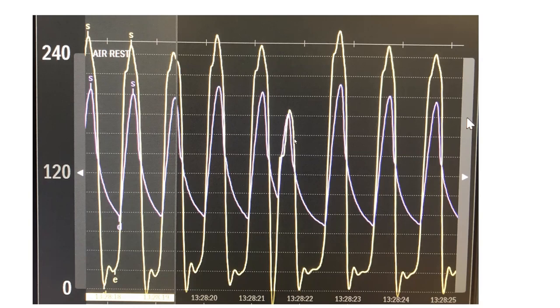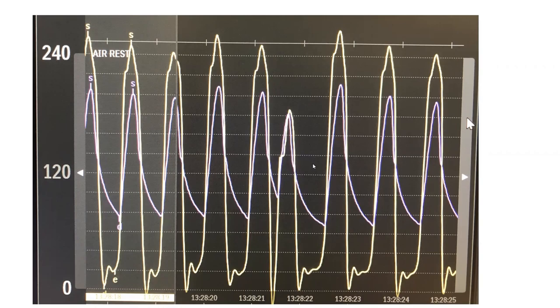Another thing that helps here is the pause. After the pause, you can see the aortic pulse pressure increases rather than declines. The gradient rises as well — everything rises: LV, aortic pressure, and gradient. So we don't have a Brockenbrough phenomenon, which is further evidence that this patient does not have HOCM. It is aortic stenosis — not dynamic obstruction.